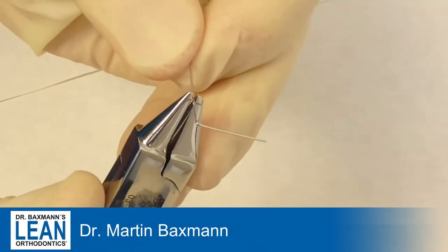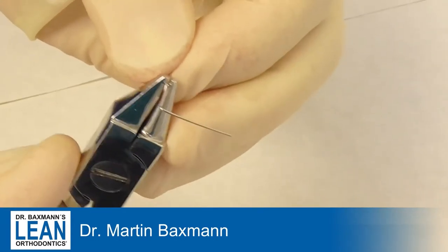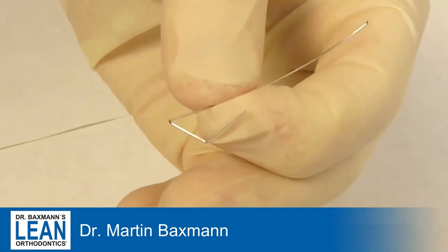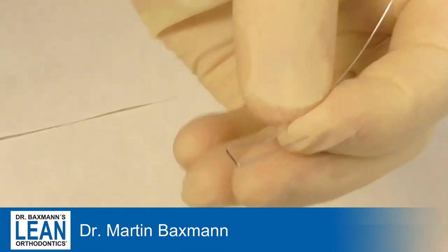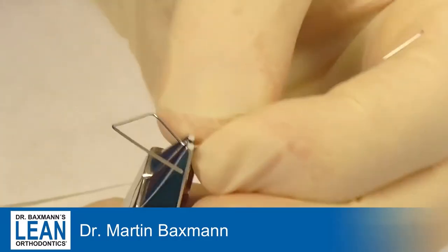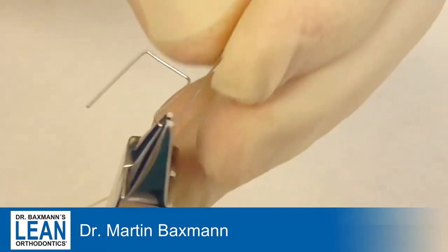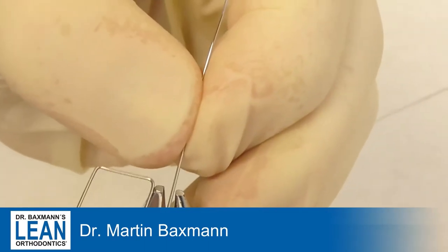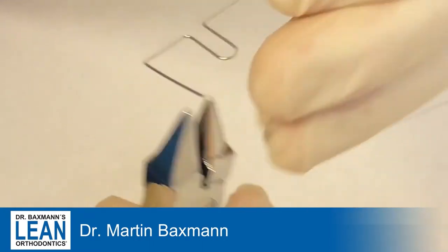Today it's going to be a really complex wire that we are bending. It's an 018 stainless steel and we use a loop bending plier or a bird plier, whatever you prefer. We had an impacted canine — a palatally impacted canine that has come through in the palate — and we want to bring it over the bite, correct the crossbite and position it correctly. So what we need is a really complex wire: a combination of a T-loop and quite a few helices as well, but you will see.